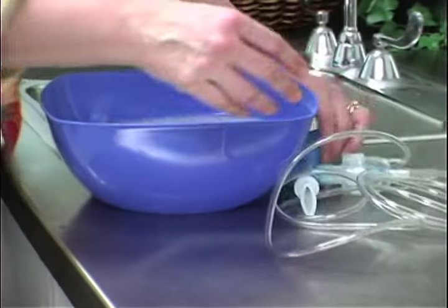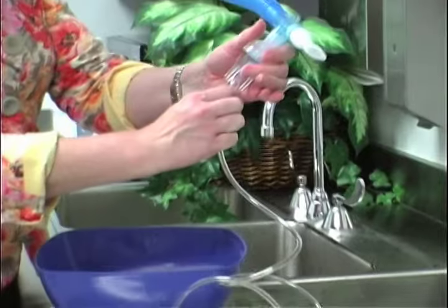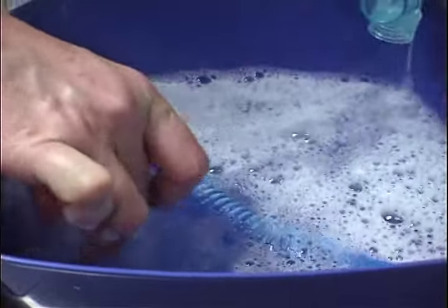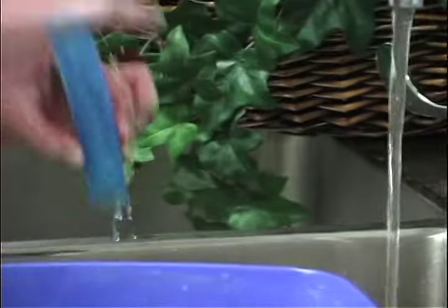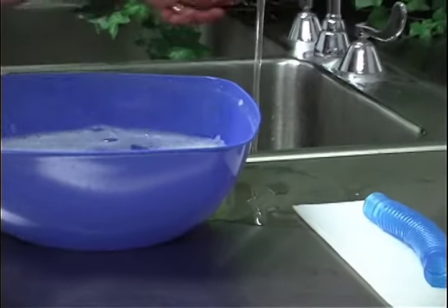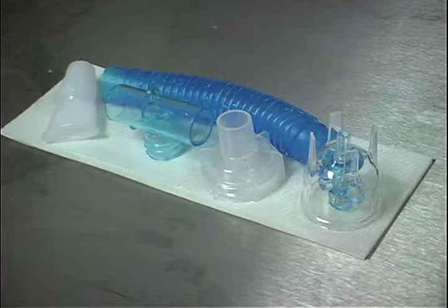After each treatment, you will need to take the nebulizer apart and wash all parts, except for the air tubing. You will wash the parts in warm, soapy water. Rinse with clean water, shake off the excess, and place the parts on a paper towel to air dry. Once it's dry, store in a clean container.